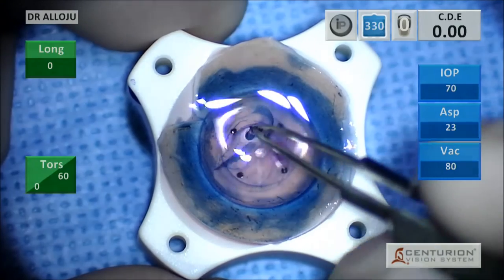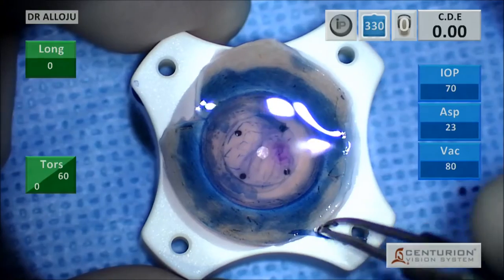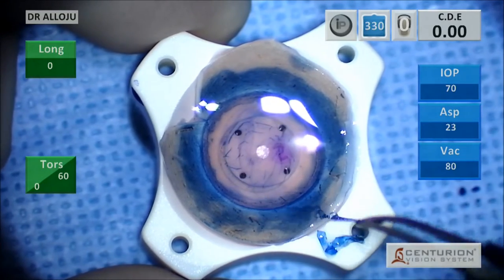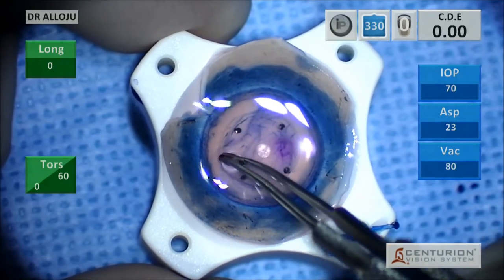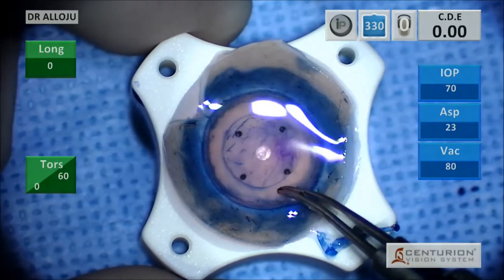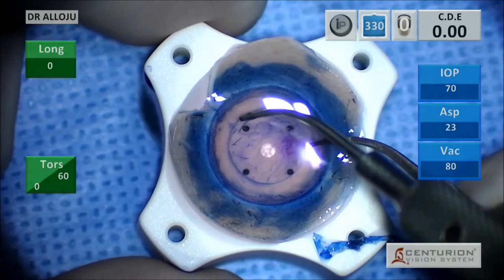The first thing I do is I remove the peripheral rim. You want to be careful that the graft isn't attached to the peripheral rim in case you didn't trephinate all the way through. And then what I'm doing is I'm tamping down the peripheral edge or the peripheral rim so that I'm able to actually get underneath the graft.